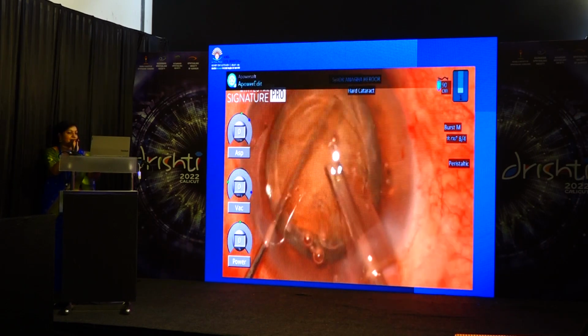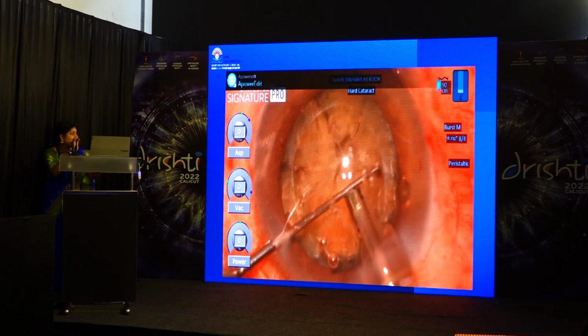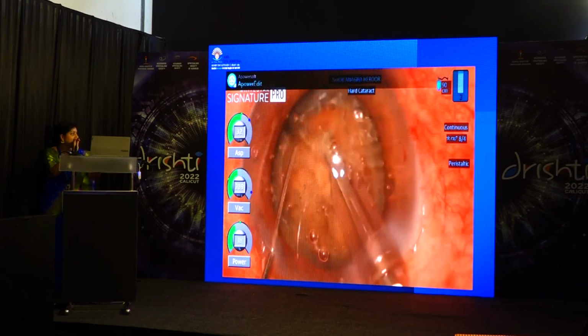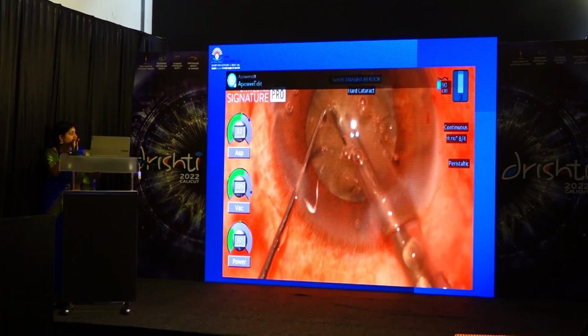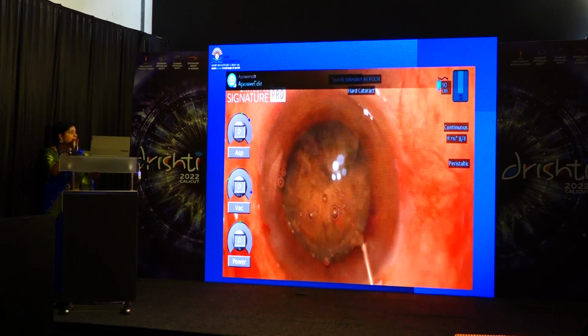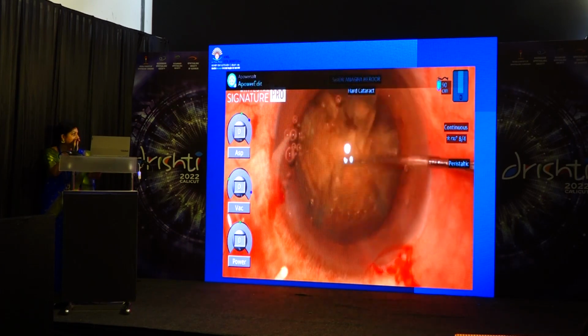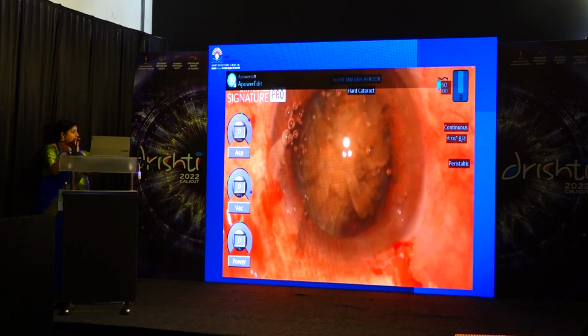This is a place where we are also using the softening procedure. So you have cubes, and it's very easy to just separate out the pies from each other, and then it becomes easier to remove. It also reduces the phaco energy that is used in these patients compared to doing a phacoemulsification.